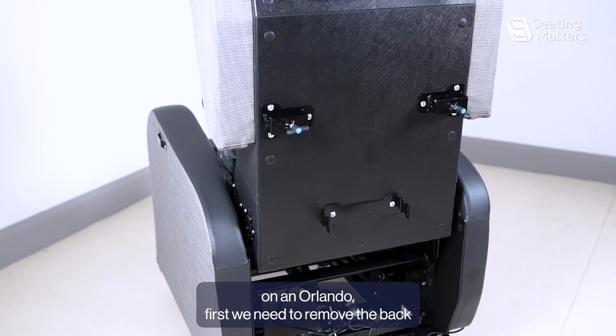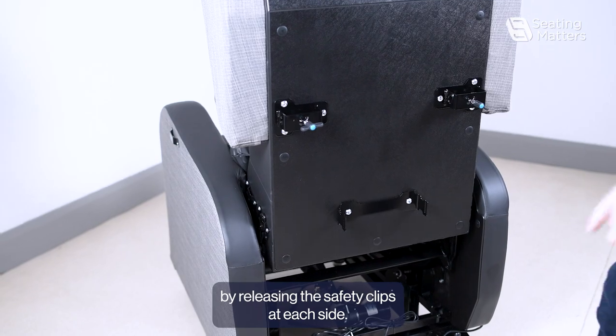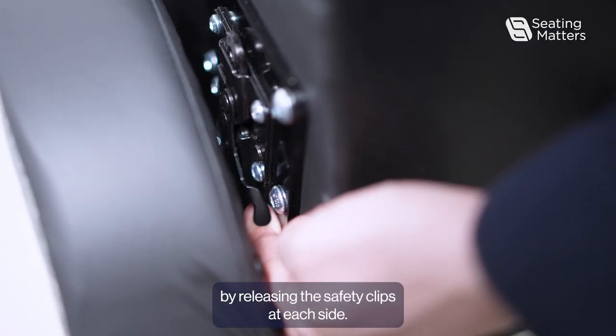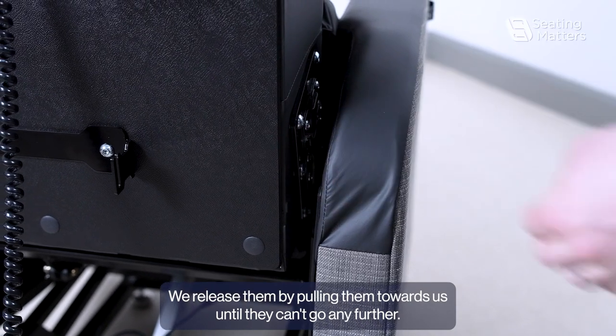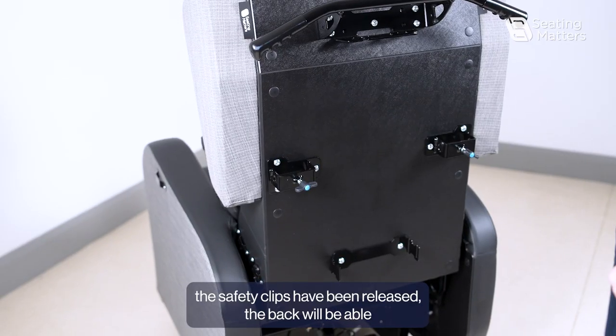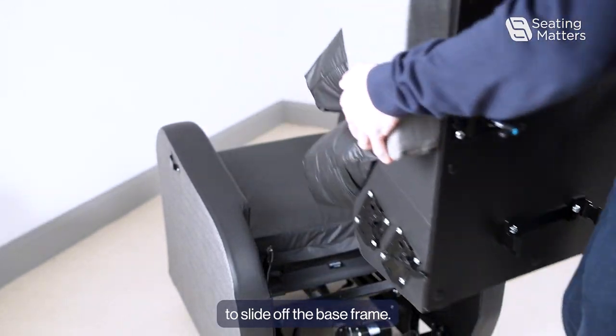To adjust the seat depth on an Orlando, first we need to remove the back by releasing the safety clips at each side. We release them by pulling them towards us until they can't go any further. Once the safety clips have been released, the back will be able to slide off the base frame.